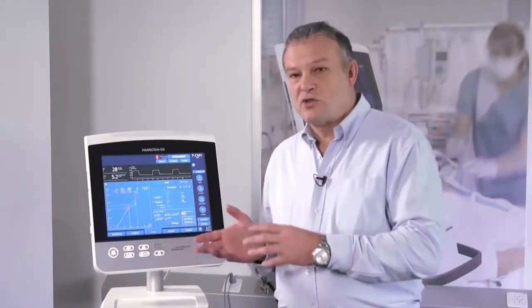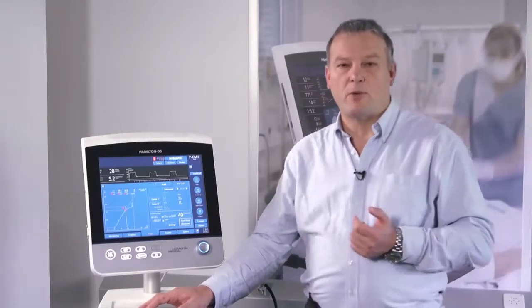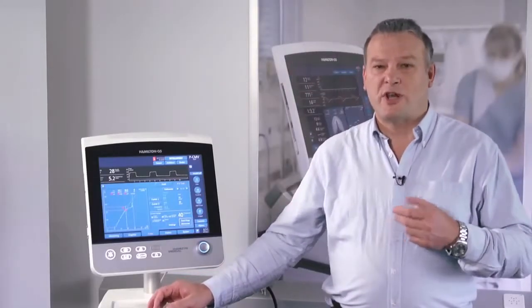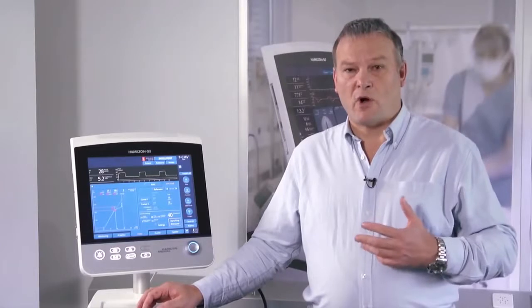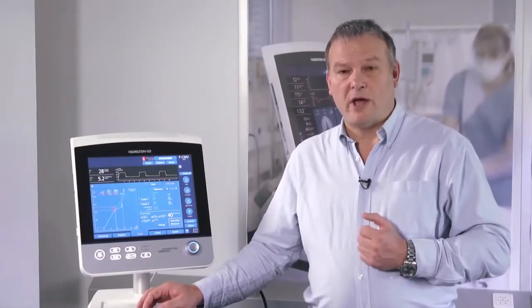Now we've created a very nice inspiratory and expiratory curve, which allows us to understand what is going on in the lung during ventilation. So when do we use the PV tool? There are many patients that become hypoxic. Not all of them are open to recruitment manoeuvres, but those that are, we can demonstrate how much volume has been recruited. Patients we wouldn't use this on include those with severe intracranial trauma or bleeding, those where severe rise in pressure has caused harm in the past, and those with a pneumothorax or high risk of developing pneumothoraces.